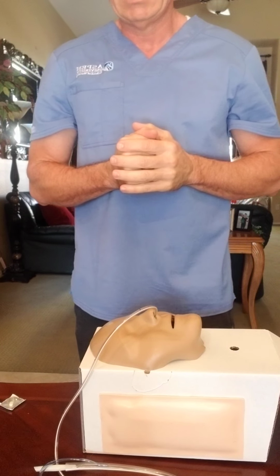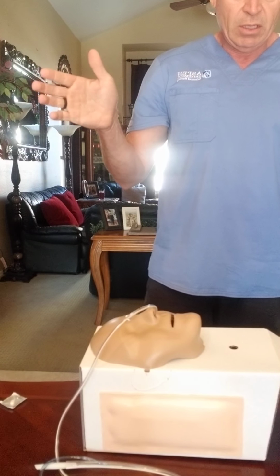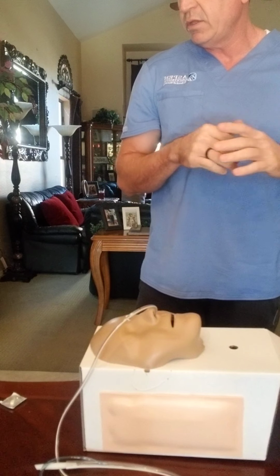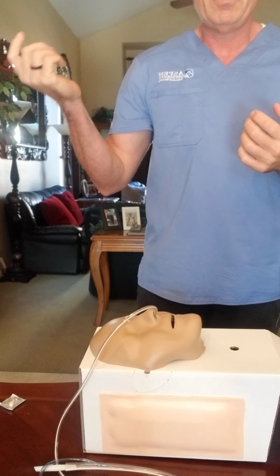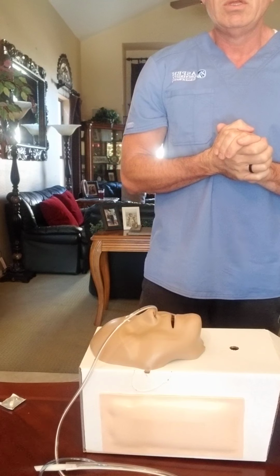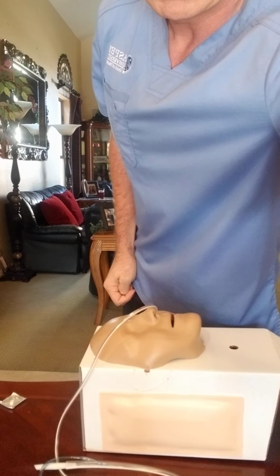I'm going to give him his call light and make sure the bed rails are up and everything is safe. If you feel anything, please use your call light or remove privacy. And I'm going to go document, and that's NG tube medication.